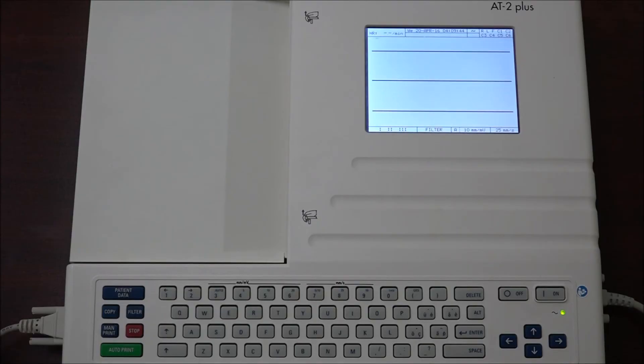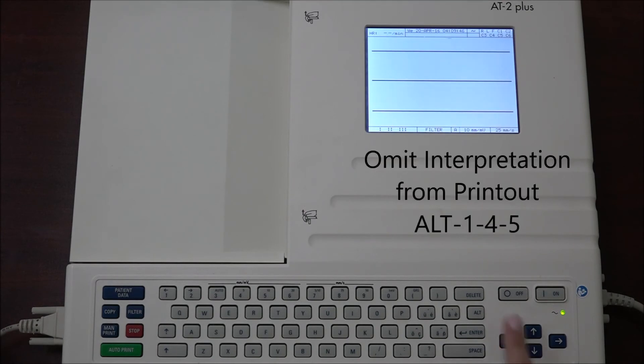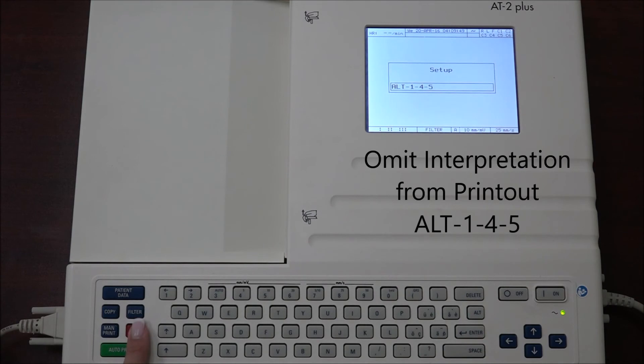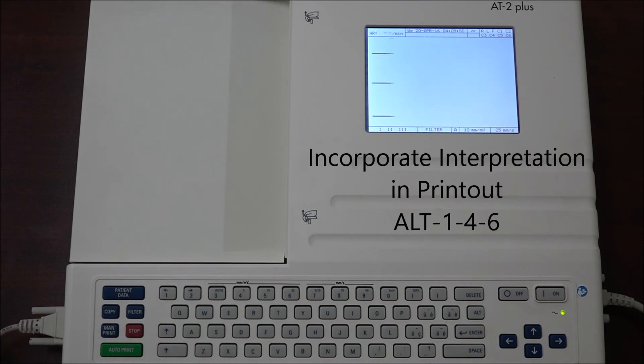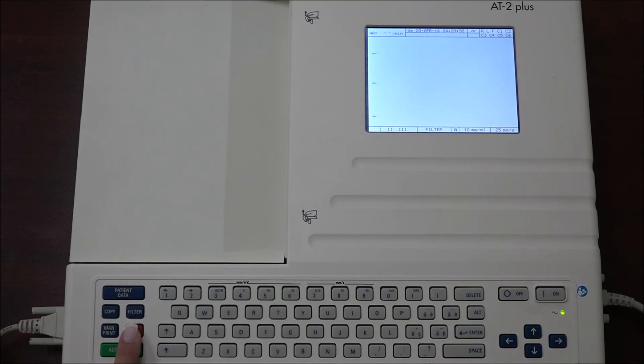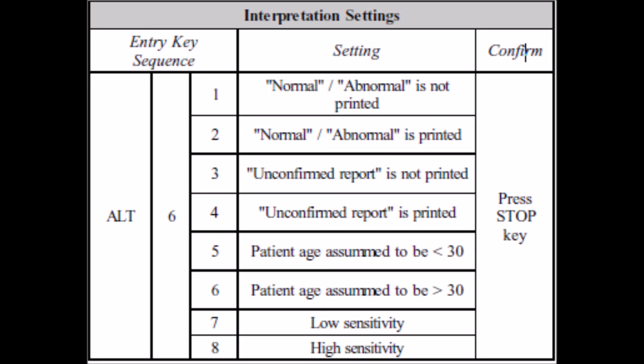To have the interpretation omitted from printout in format 1, press the ALT key followed by 1 4 5. To incorporate the interpretation in the printout, press the ALT key followed by 1 4 6 and confirm by pressing stop. The following interpretation settings can also be adjusted with the following codes.